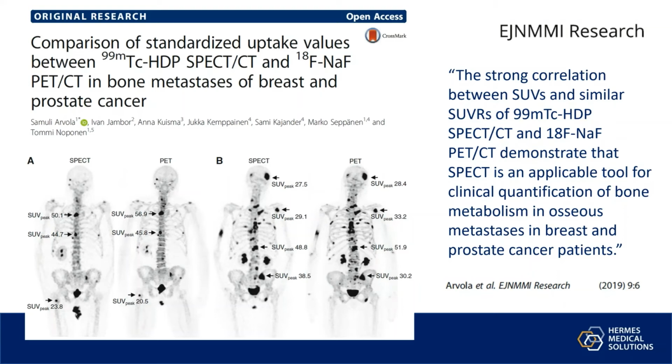And they find that SPECT is an applicable tool for clinical quantification of bone metabolism in osseous metastases in breast and prostate cancer, which is great news for hospitals without access to a PET scanner or to the fluoride tracer for these patients.